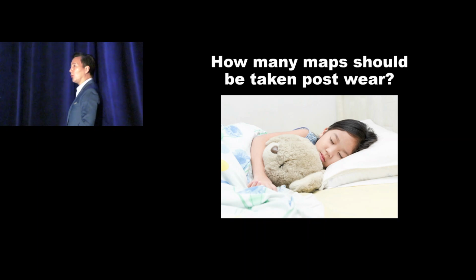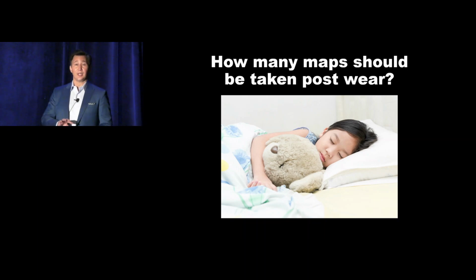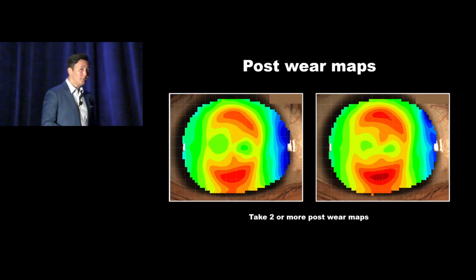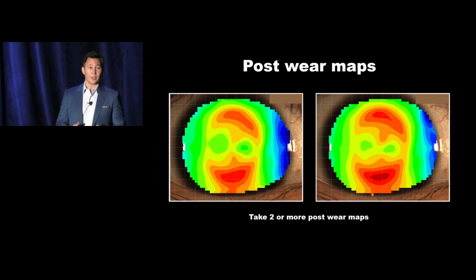Now, what about post-wear? If you take 4 baseline, how many should you take after treatment? The story is, take a minimum of 2. Ideally, when you're first starting in ortho-k, take 4.